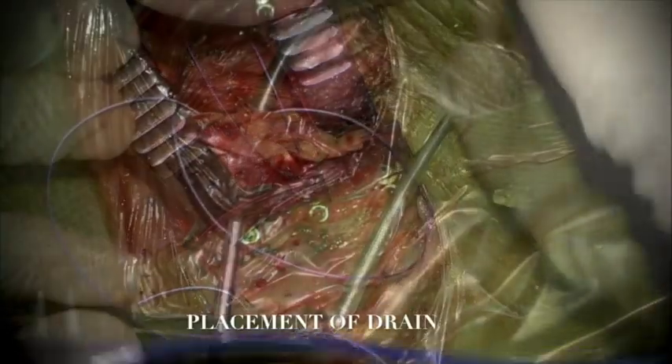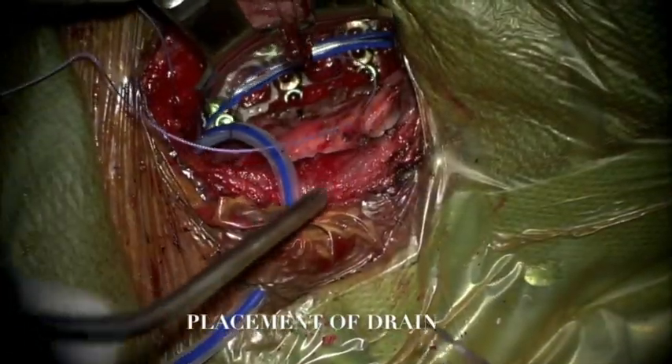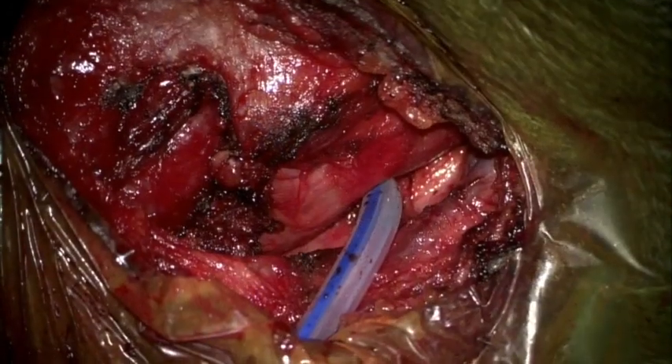We then placed the drain in position, externalizing it through a separate outlet and securing it with a 2-0 silk stitch. The omohyoid muscle was returned to position and sutured together. The wound was closed with subcutaneous 2-0 Vicryl and 3-0 Vicryl intermittent stitches. Steri-Strips, Telfa, and Tegaderm were used for dressing.